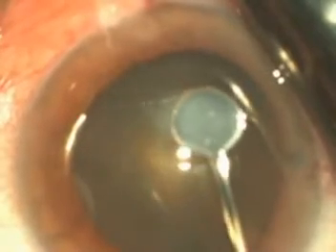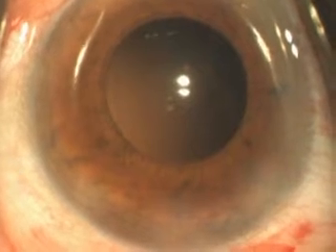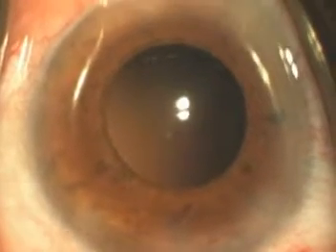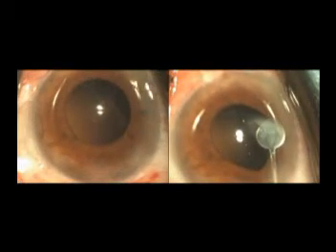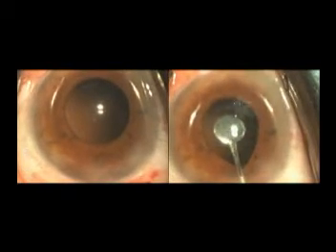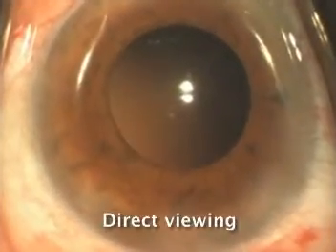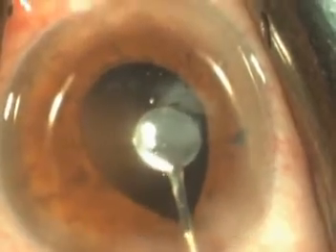The lesions were not present before phacoemulsification. In another case, the same abnormal lesions were found. Interestingly, these endothelial lesions were not seen when viewed directly. Compare these two views in the same patient: in the footage on the left, the lesion is not recognizable, whereas it is clearly seen in the footage on the right.